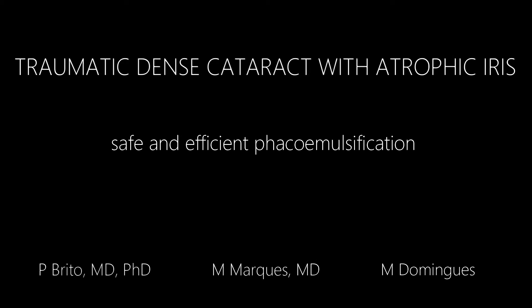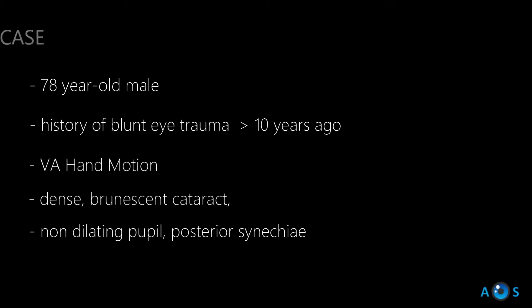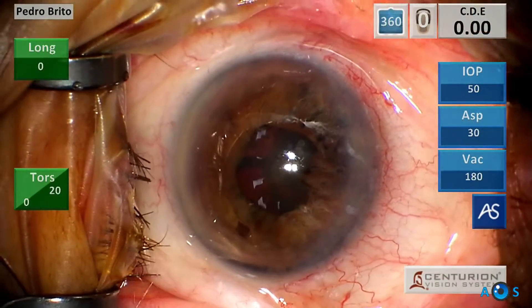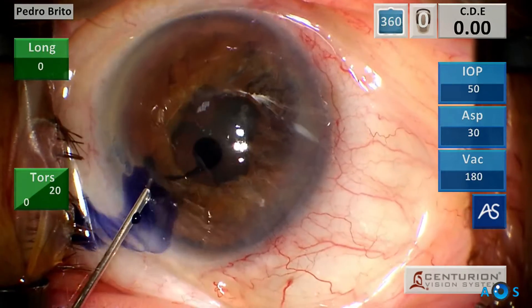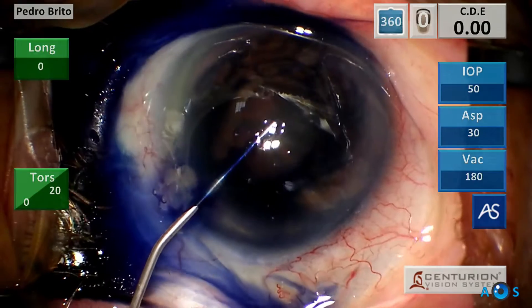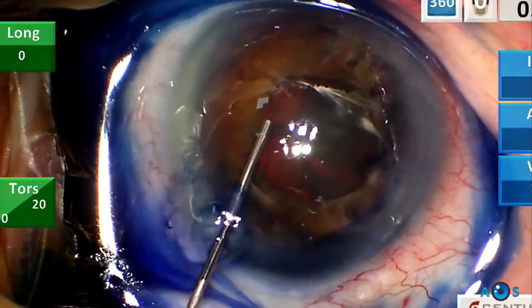In this video we present a case of a very dense cataract resulting from blunt eye trauma many years ago. The patient presented with hand motion vision and a non-dilating pupil with posterior synechiae. Phaco emulsification surgery was proposed, and as we will see with a modern phaco machine and a step-by-step approach, such cases are successfully managed.